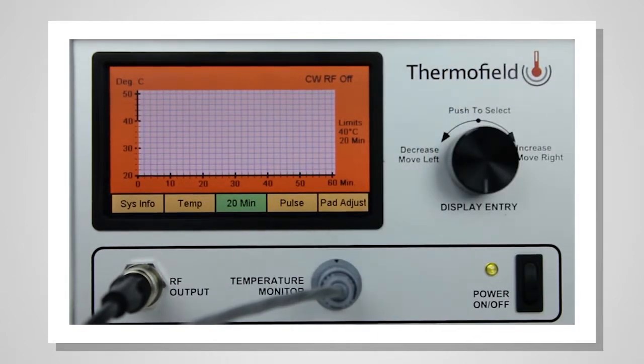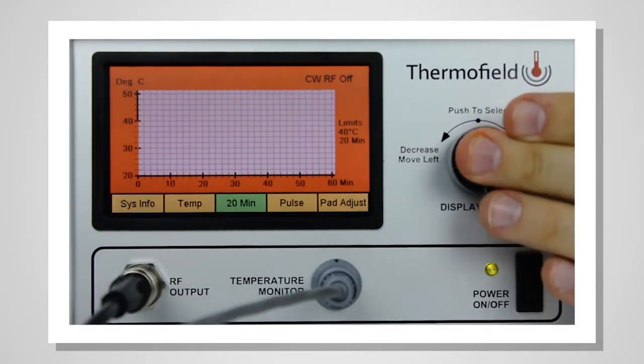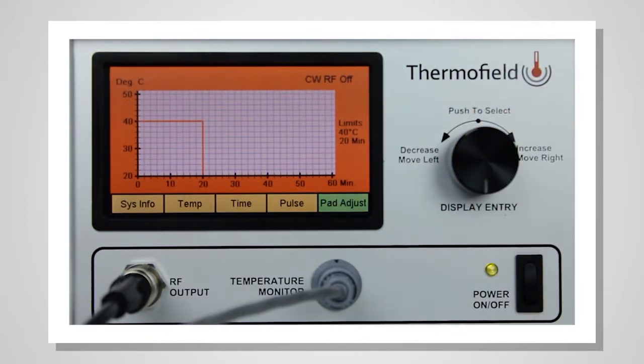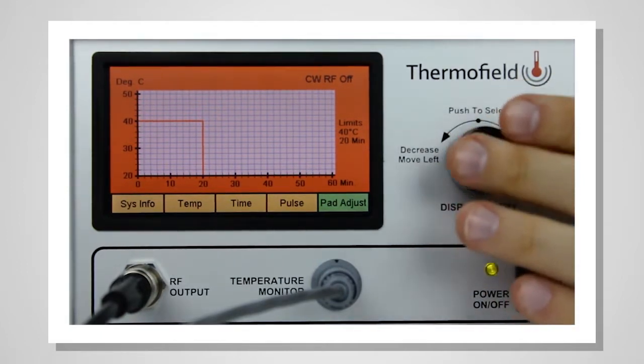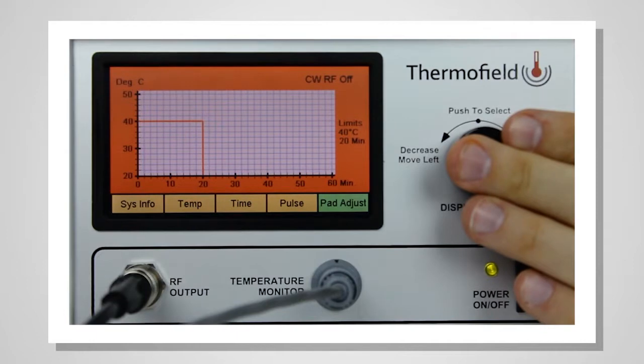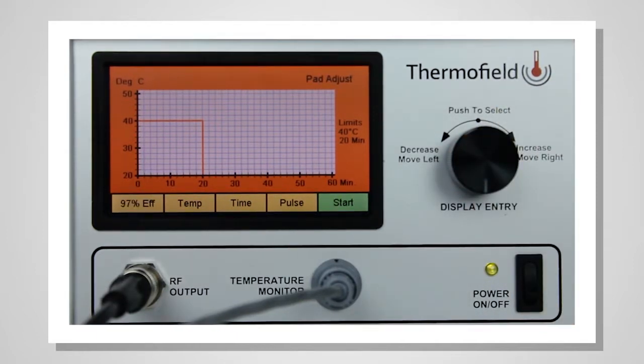Once you've confirmed the treatment time, the PAUSE pane will be highlighted and will read PAD ADJUST. Appropriately place the pad on the patient and push the knob to adjust the pad for treatment. The pane will then say PAUSE and the status line will display PAD ADJUST.